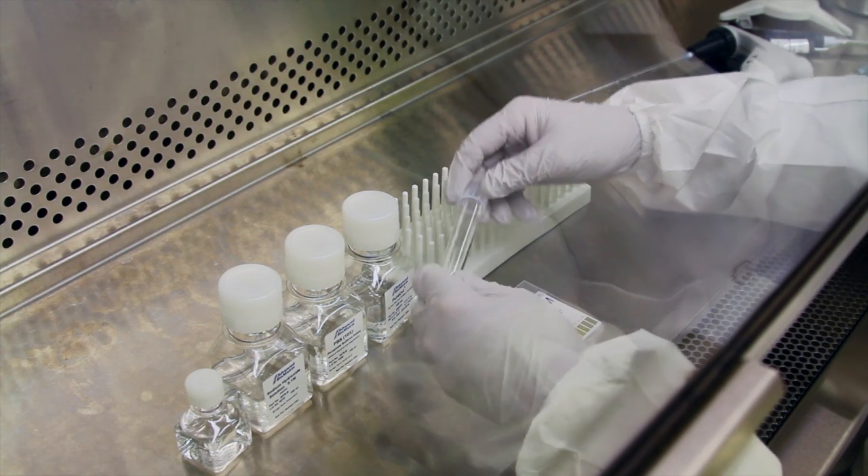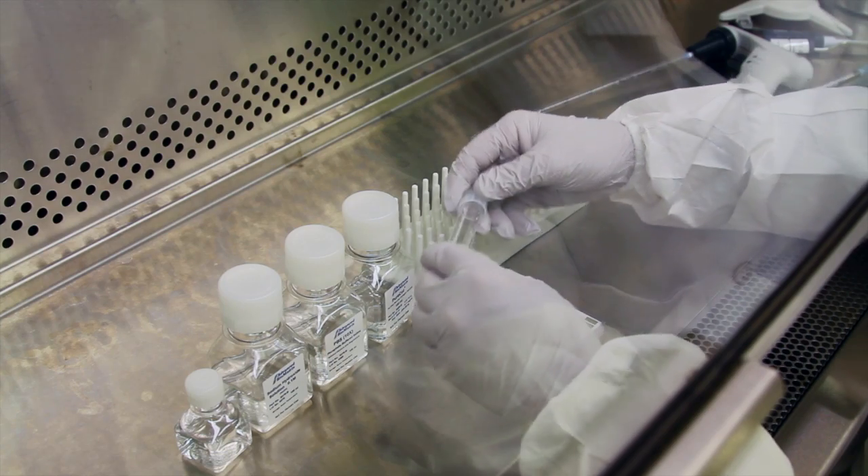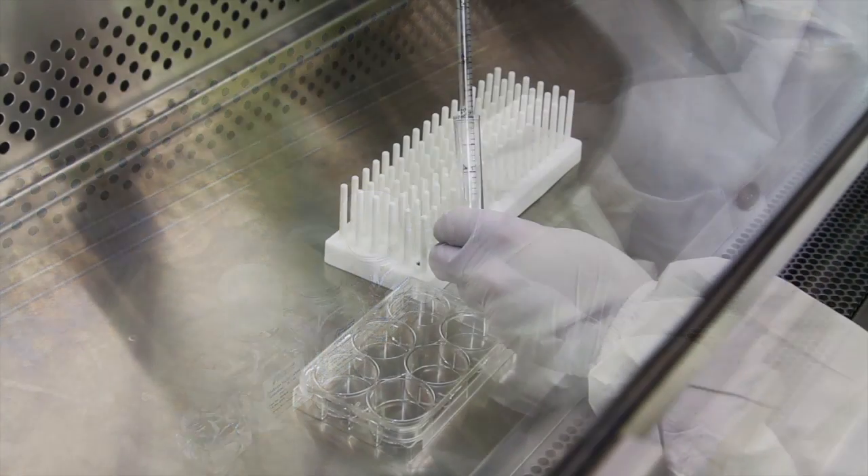To prevent gelation of the collagen, maintain the collagen mixture at a temperature between 2 and 10 degrees Celsius.